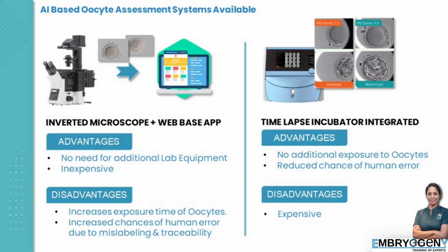The second system, as described towards the right, for image capture is integrated within the time-lapse incubator, which takes care of not introducing additional oocyte exposure for image capture, but at the same time, the major disadvantage is its cost. But I'm very hopeful that in the near future, the cost will come down.